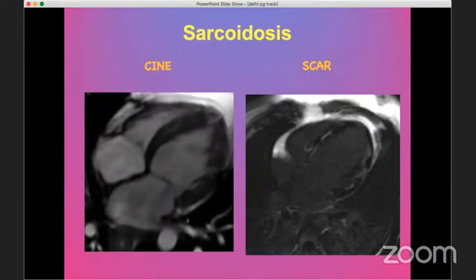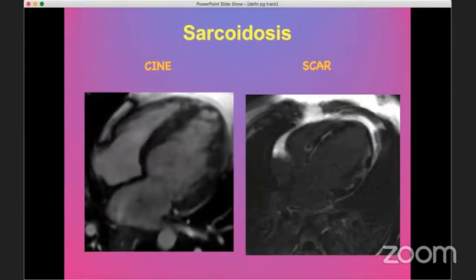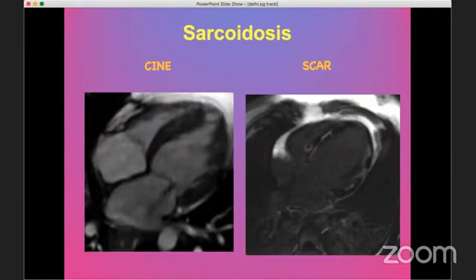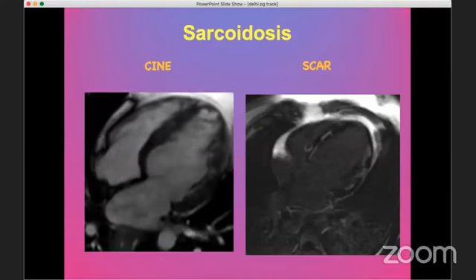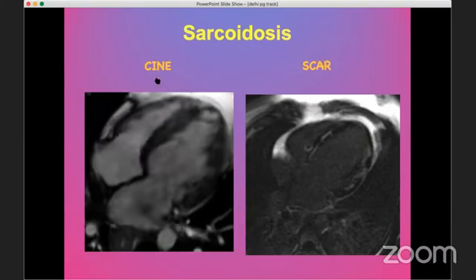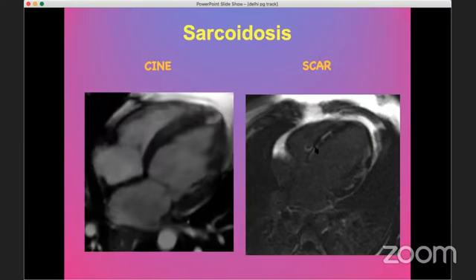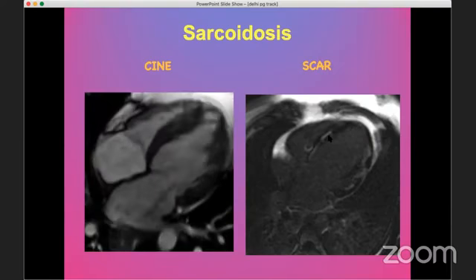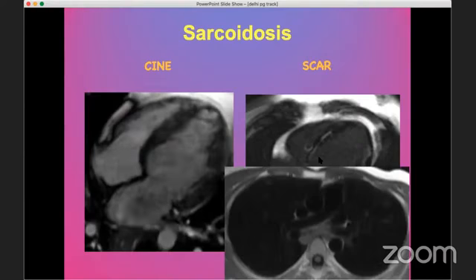Moving on to inflammatory cardiomyopathies, and sarcoidosis is one such disease. This is a patient who had presented with worsening heart failure, LV dilatation, LA dilatation, LV dysfunction, regional wall not matching a coronary territory. And what is important is septal and lateral mid-myocardial enhancement, starting without involving the subendocardium, which is classical for sarcoid.